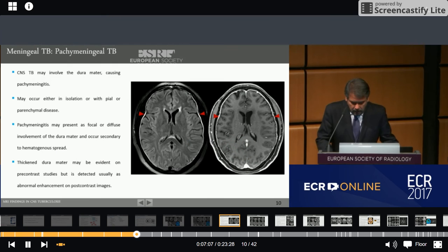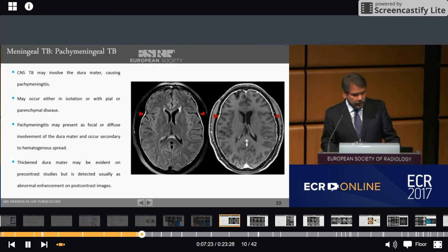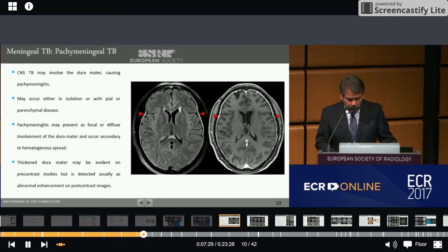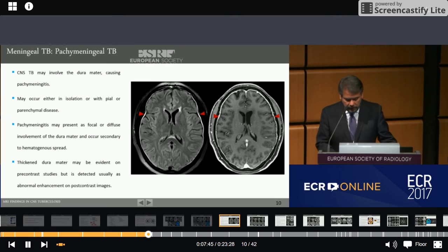Pachymeningeal TB can occur as either isolated neural involvement or with associated leptomeningeal or parenchymal lesions. It is important to diagnose pachymeningeal TB because it responds well to anti-tubercular treatment and should be considered in the differential diagnosis of pachymeningeal abnormalities. If there is evidence of TB elsewhere in the body, it may further suggest the diagnosis. However, the appearance of focal and diffuse pachymeningitis on MR imaging is non-specific and may be seen in a large number of inflammatory and non-inflammatory conditions.